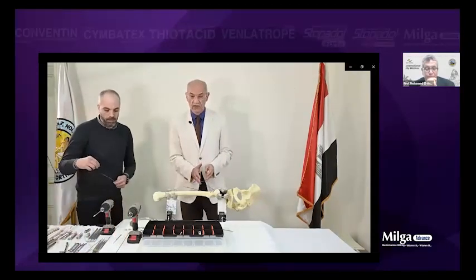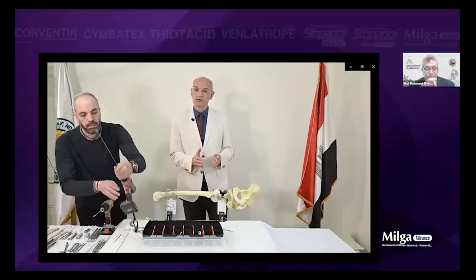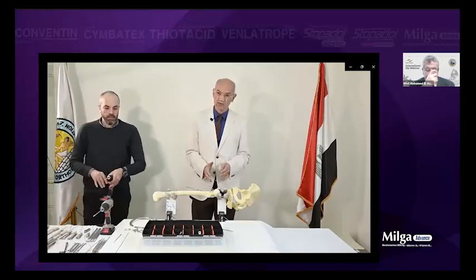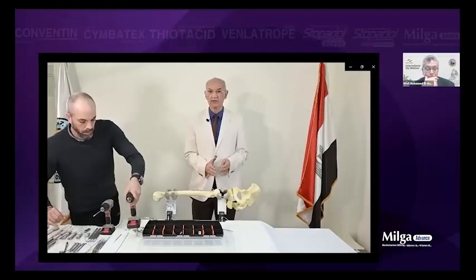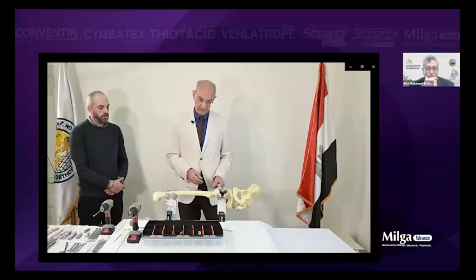As I've told you, you can have very good fixation of the proximal femur, because people always complain that it's very difficult to fix the proximal femur by external fixation, and they warn you from fixing the proximal femur if you have osteoporosis. This is not true. For every problem, you need a solution.